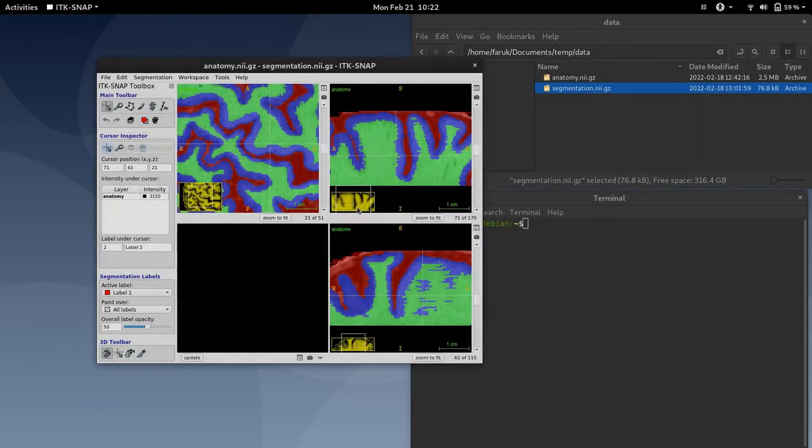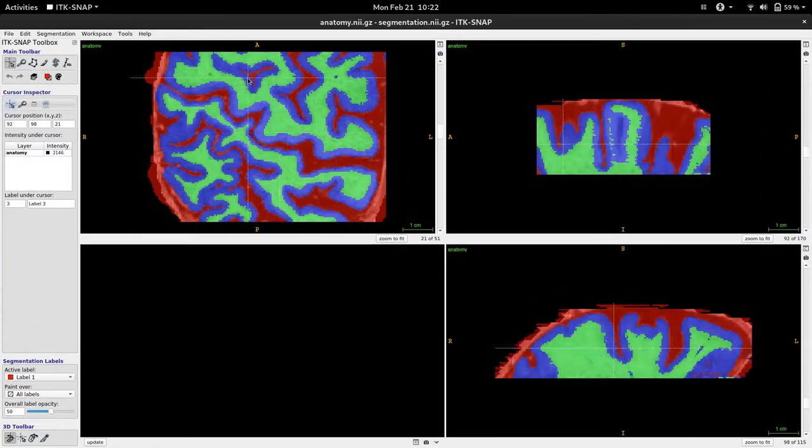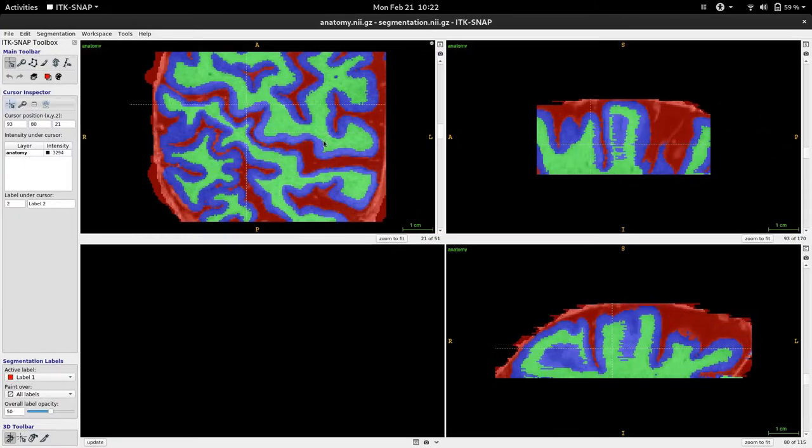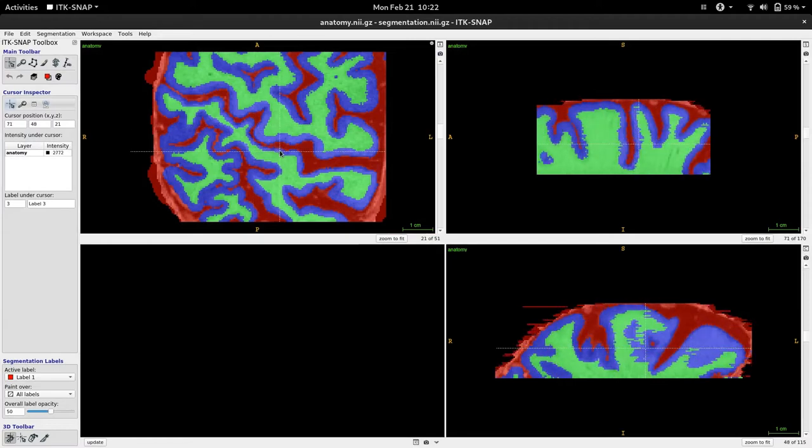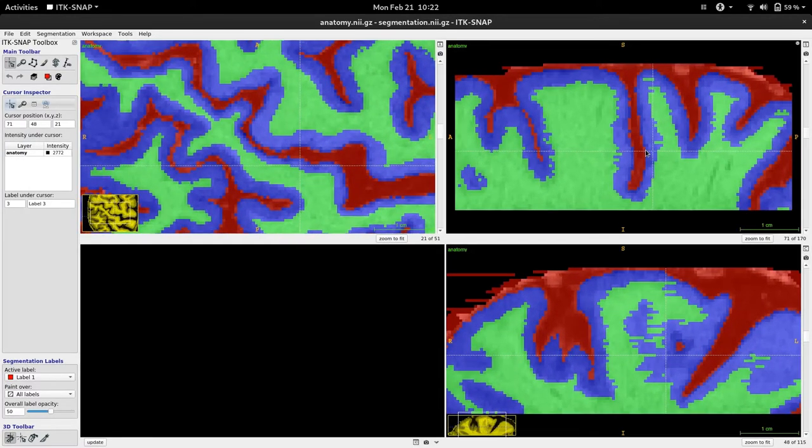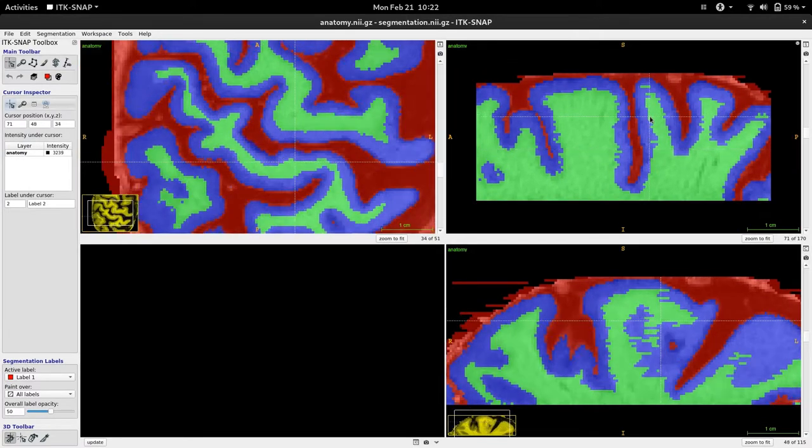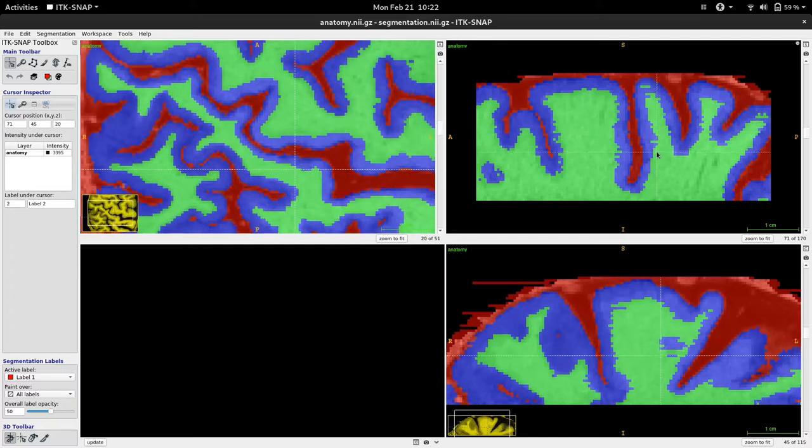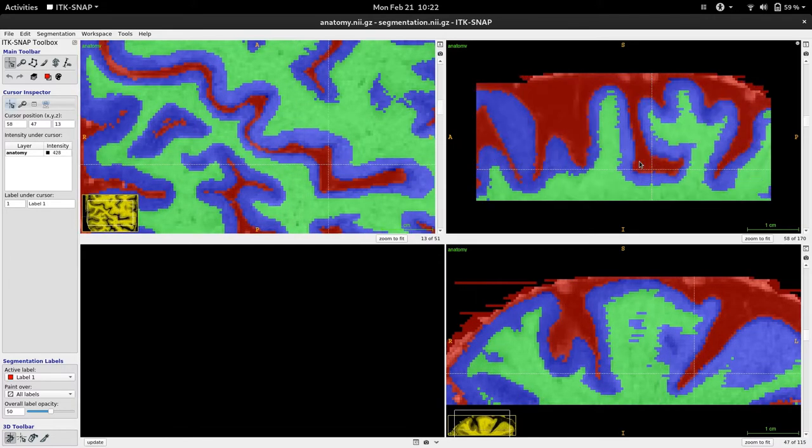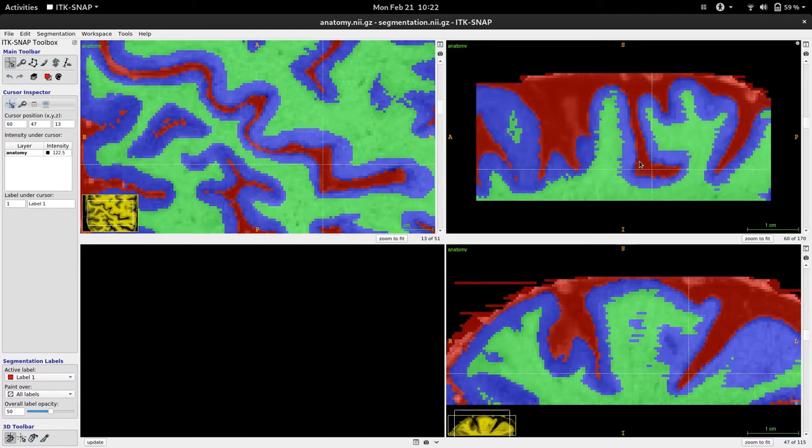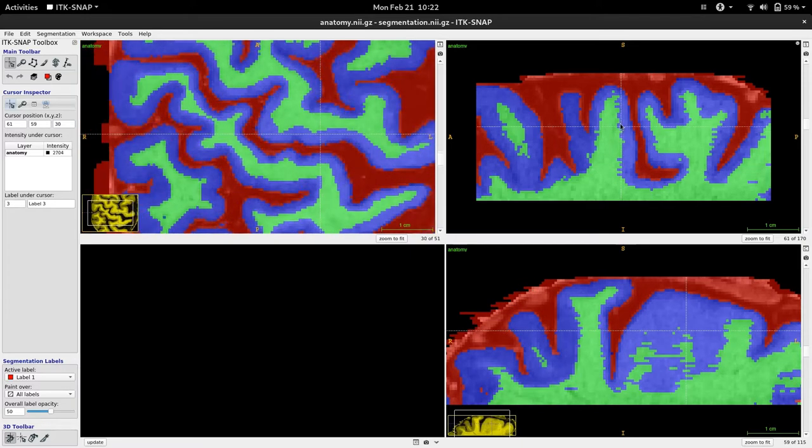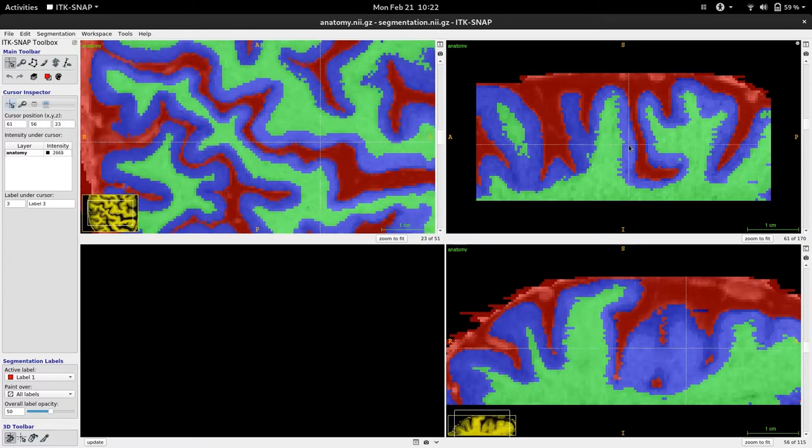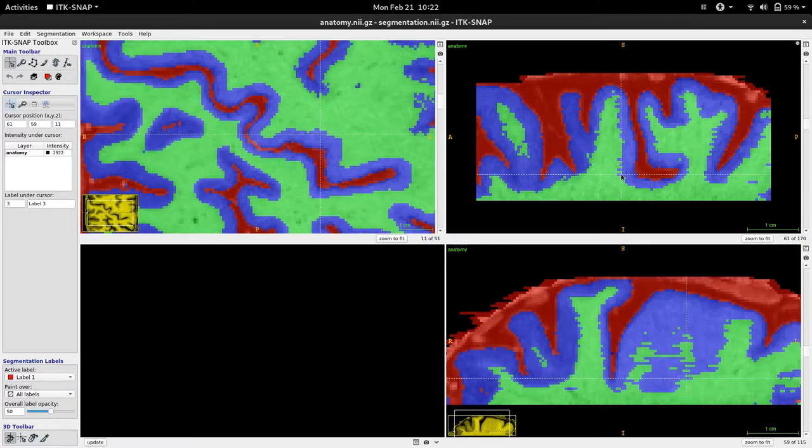I am loading in ITK-SNAP. Here you can see that the white matter and gray matter borders are a bit jittery. Especially when I go through this slide you can see that this border is sometimes too much in, sometimes too much out.